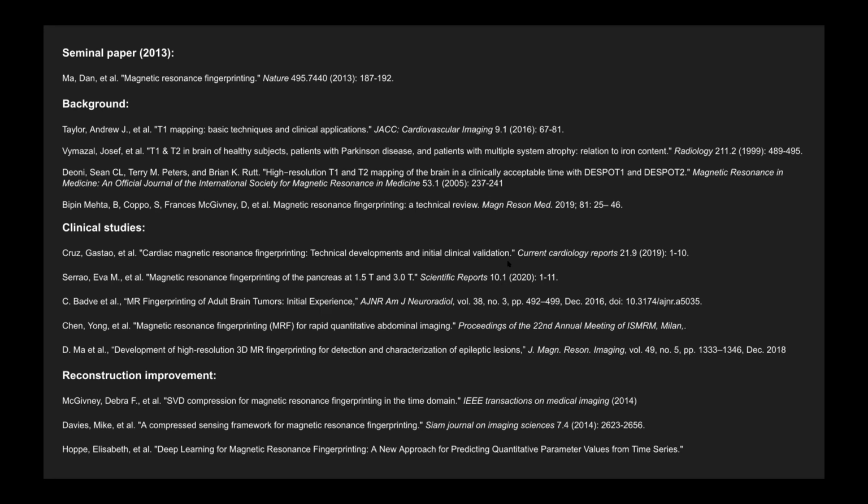So I know that it changes the reliability aspect, at least with stuff I've seen where they did different field strengths. It can change the distribution you get when you're acquiring stuff. It can spread out your statistical distribution or narrow it, depending on the field strength and different parameters. So it can change your reliability a little bit. I don't think it's hard and fast that increasing your field makes it worse or makes it better. I think it depends on the specific thing you're trying to do.